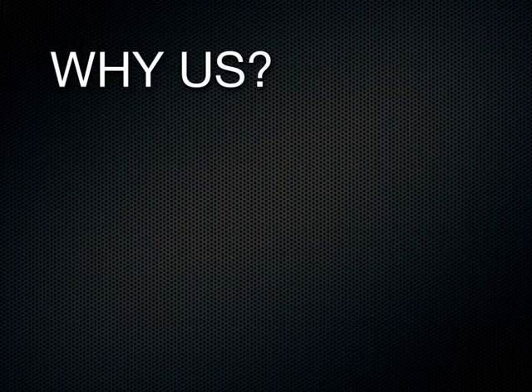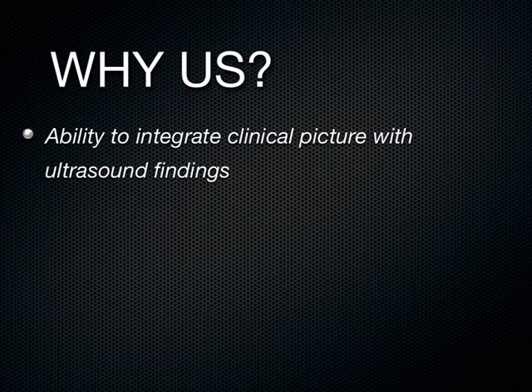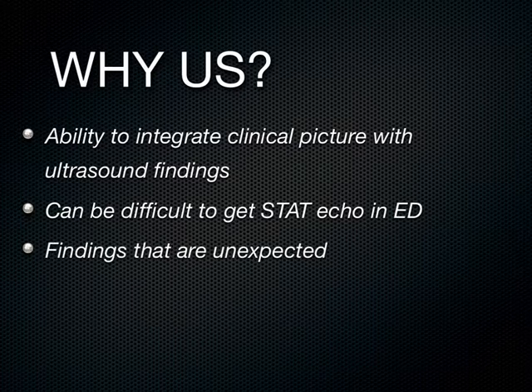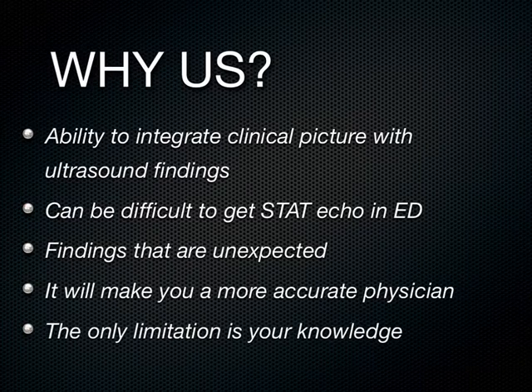So that's a good reason to think about why we should be doing cardiac ultrasound, because we have the ability right there to integrate the clinical picture with the ultrasound findings. We know sometimes it's difficult to get cardiology to come down and do a stat echo depending on the time of day. And by stat, maybe it gets done in 15 minutes, maybe 20 minutes. Stat for me means in the next 60 seconds. And in that patient, it was an unexpected finding. I think all that makes you a more accurate physician, the only limitation being your knowledge.